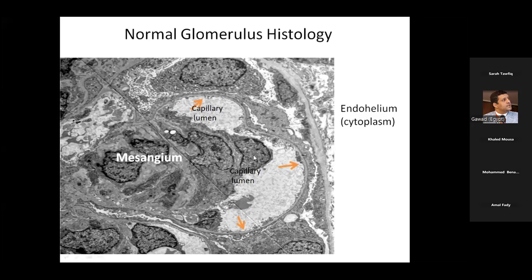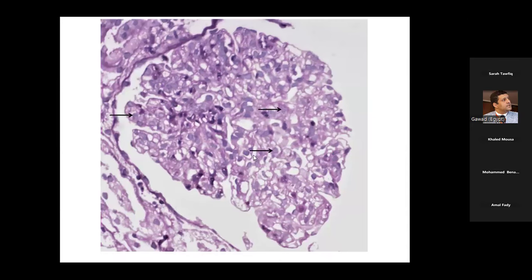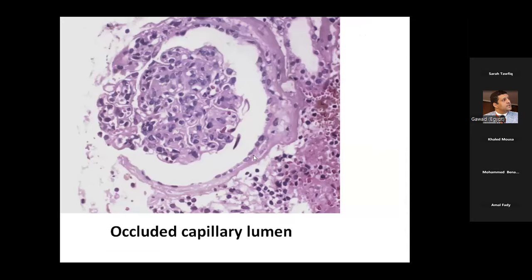Okay, great. Let's continue to concept number two, where we will have intruders. So these capillary lumina are occluded or empty. Actually, these are occluded, but the nature of the occluding nuclei differs. Can you now appreciate the difference between these nuclei and the past nuclei?